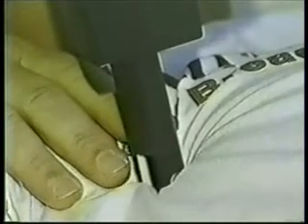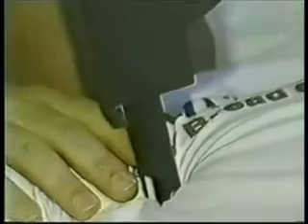Comes down. That's all it's going to do. You comfortable with that? Oh, yeah. Okay. And it just sits there, takes some measurements, all right? And it makes a decision based on what it senses. All right, what it's trying to do is make 3 changes. 1 is to lengthen the muscle, so that's a physical change.